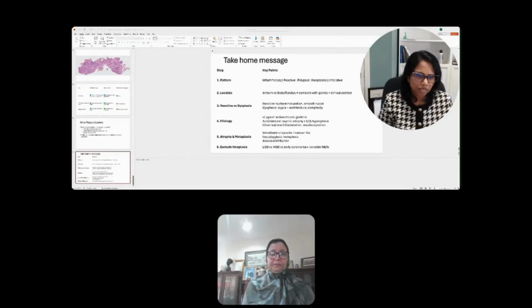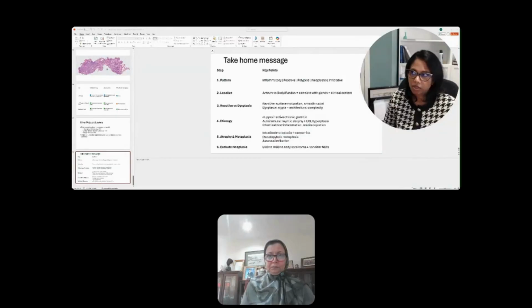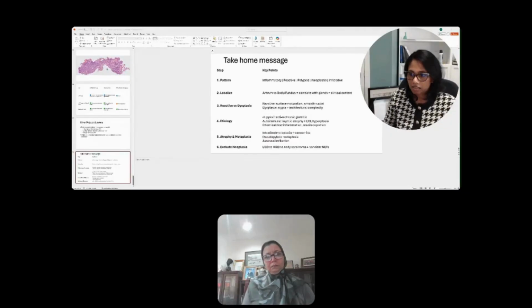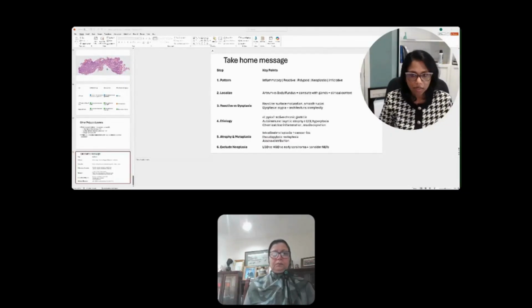We have an integrated pathology reporting system. It's called EPIC. So you have access to the patient records and endoscopic reports. To answer your question, for the most part we do have the endoscopic images available to us at the time of reporting, on the electronic database and reporting system that we use.